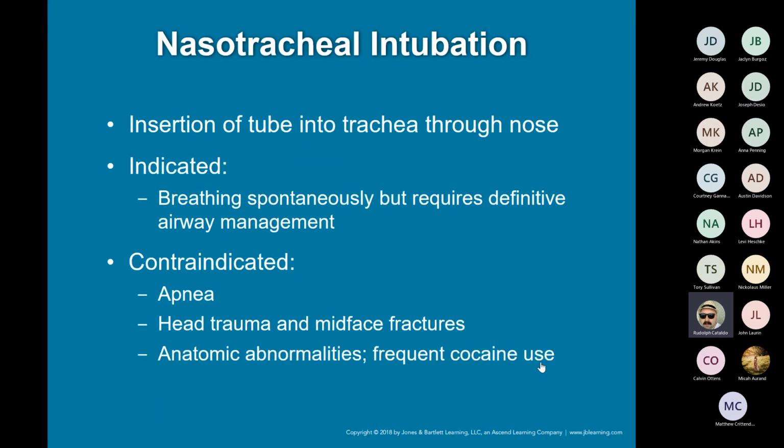Yep. Perfect. All right. So like I said, last week we ended with regular intubations, or tracheal intubations. And then this week, even for skills, we're jumping into nasotracheal intubation. So it kind of goes hand in hand.